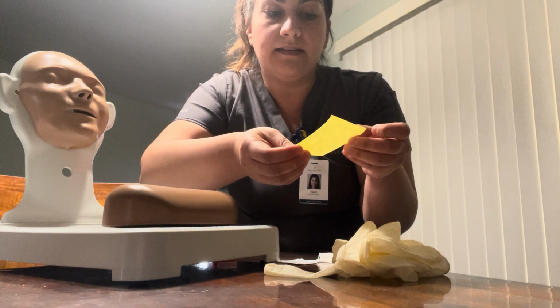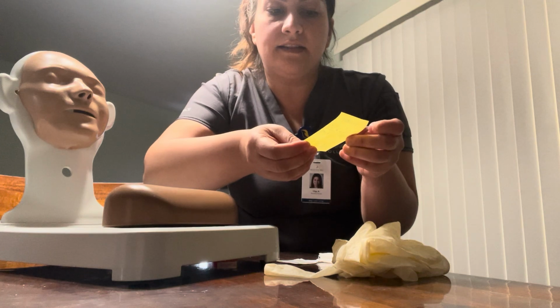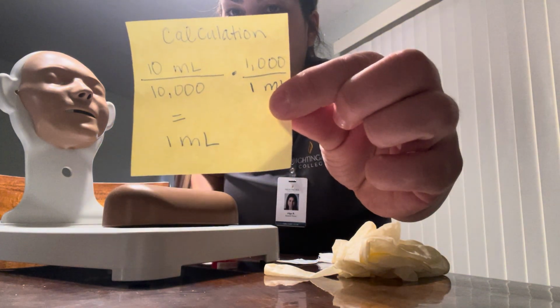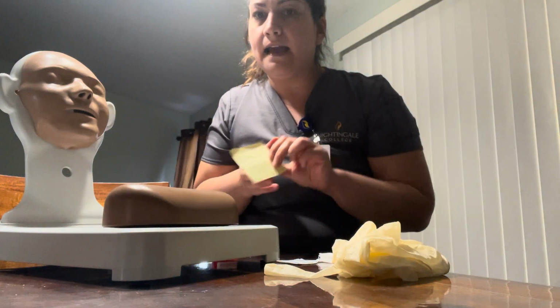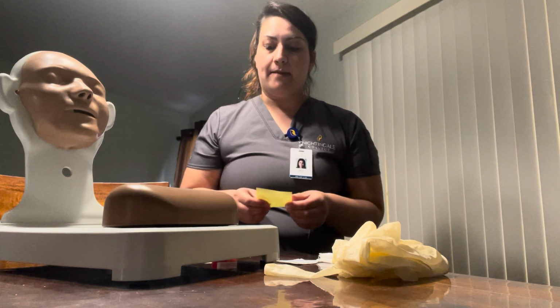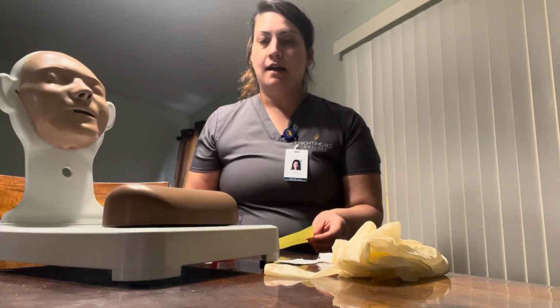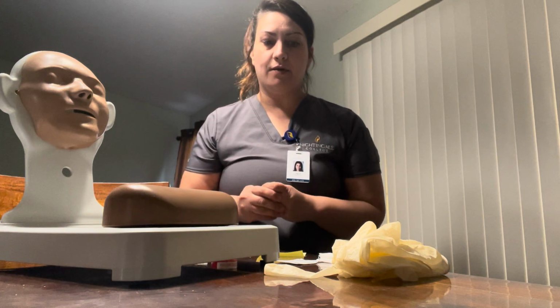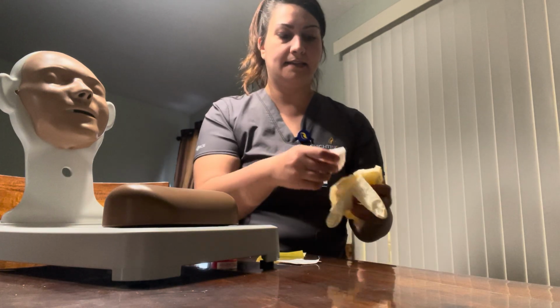It's going to be 10 over 10,000 times 1,000 over 1 milliliter, and that will equal 1 milliliter of heparin for my patient. Okay, and then next I'm going to gather all my supplies.